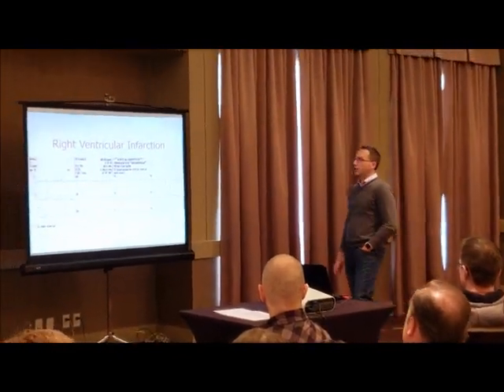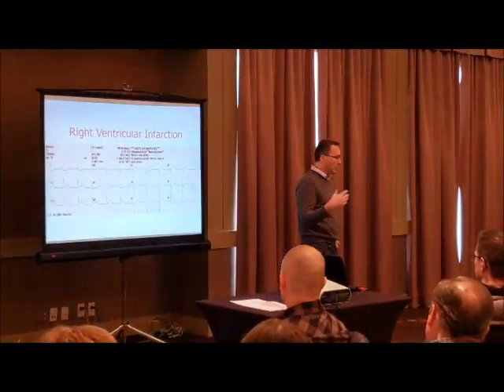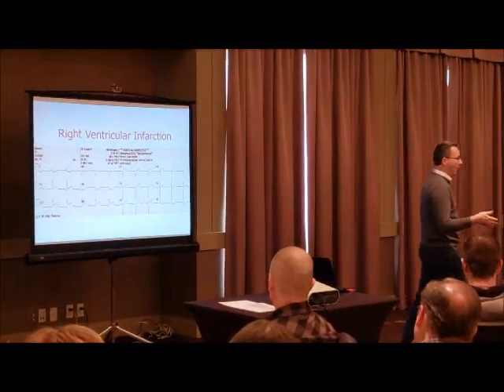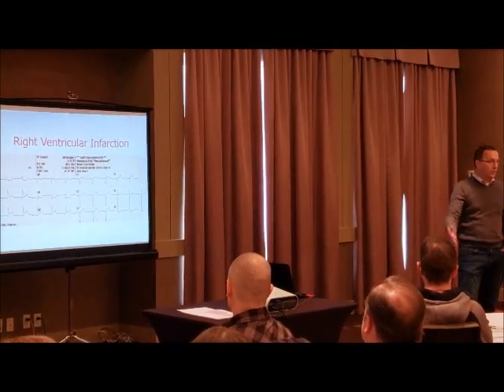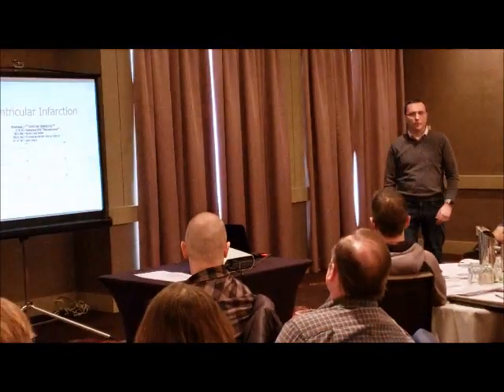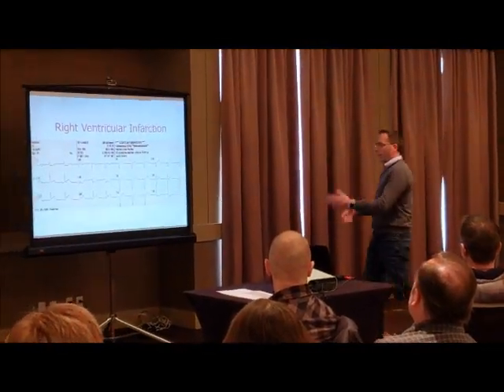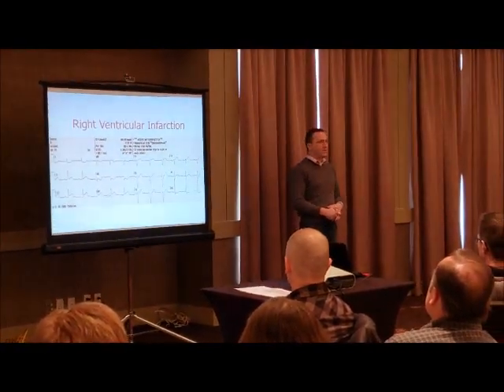So this was actually a female patient. She was 79 years old. She was out shopping with her sister, okay? So we pulled up on this strip mall, and this woman was helped into the back of the ambulance, and we started taking her clothes off, and we're getting her first set of vital signs and things like that. We're asking her questions about the history of the present illness.